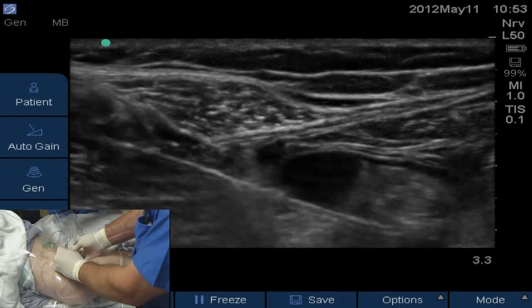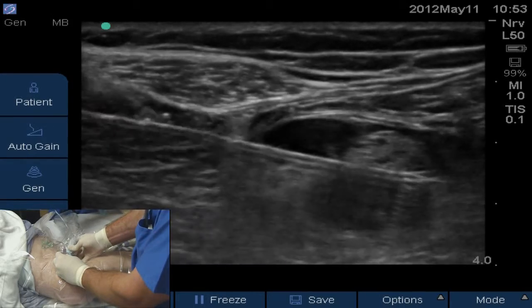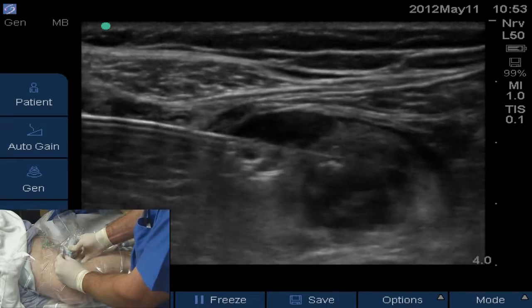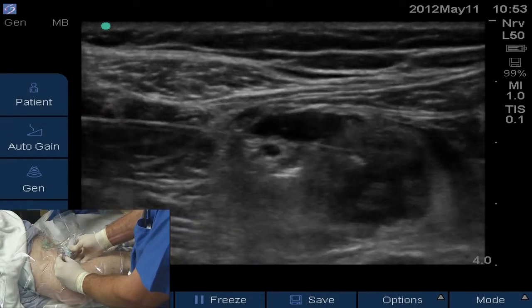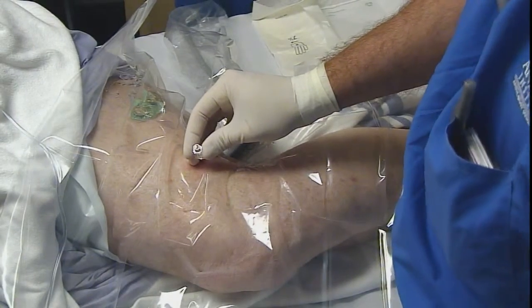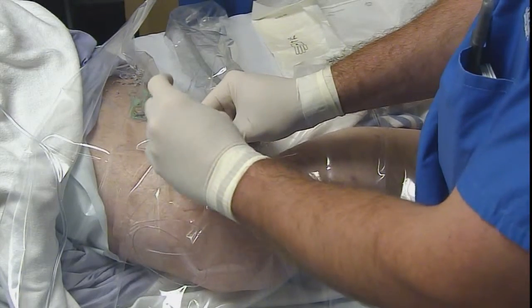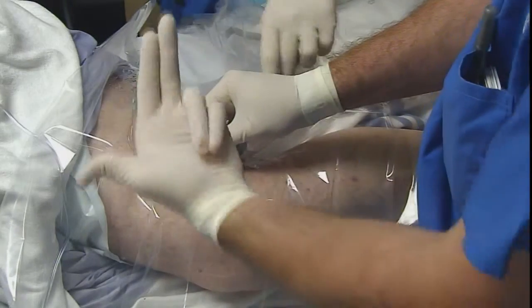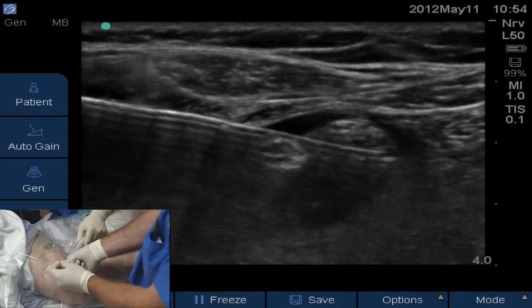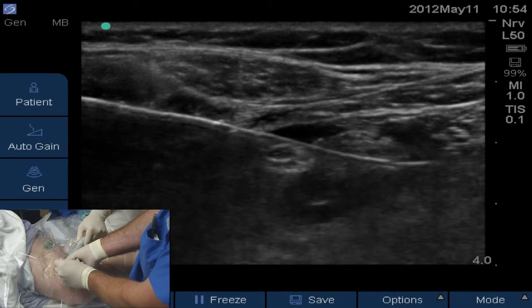Give 2 cc's there and I'll follow my injection. You can see the two nerves separated — I'm over the top of peroneal and under tibial. Give one more there, and then with the last injection relative to the tibial nerve I'll be at about 5 o'clock. Initially that's where I'll leave my needle tip and thread my catheter just past the needle tip. The bevel is up, allowing the natural curvature of the catheter to force the tip superficially as it comes out. The catheter tip is at roughly 5 o'clock relative to the tibial nerve. I'll just leave it right where it lies.